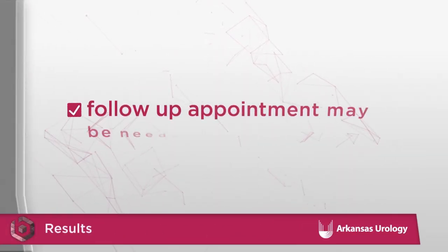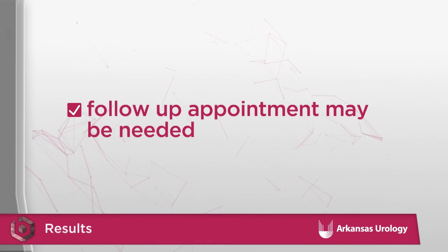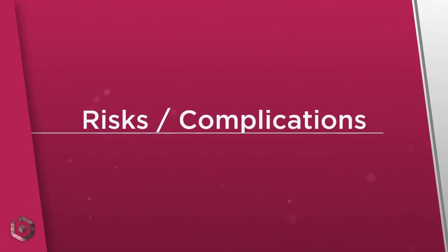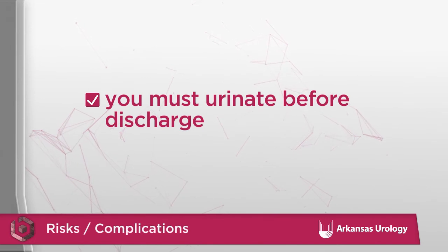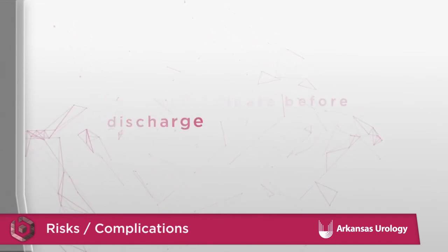Results of cystoscopy. Following your procedure, your physician will discuss your results. If a biopsy is required or your physician needs to remove any abnormalities, a follow-up appointment may be needed. Risks and complications of cystoscopy. Whether you choose to be awake or sedated, all patients must urinate before they are released to go home.